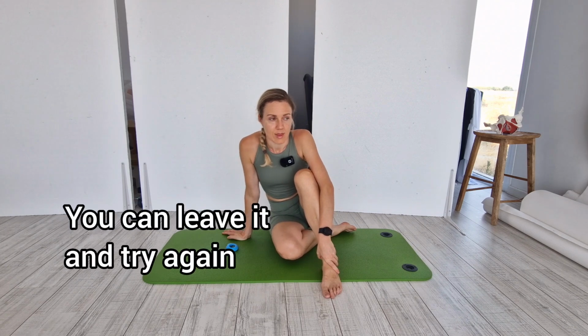Now, if you have tried all of this and it doesn't come out, again, I would suggest not to panic. I would suggest to leave it for an hour or so and try again. Now, if the second time around you can't take it out, then it's a good time to call either the person who fitted you the pessary or your gynecologist.